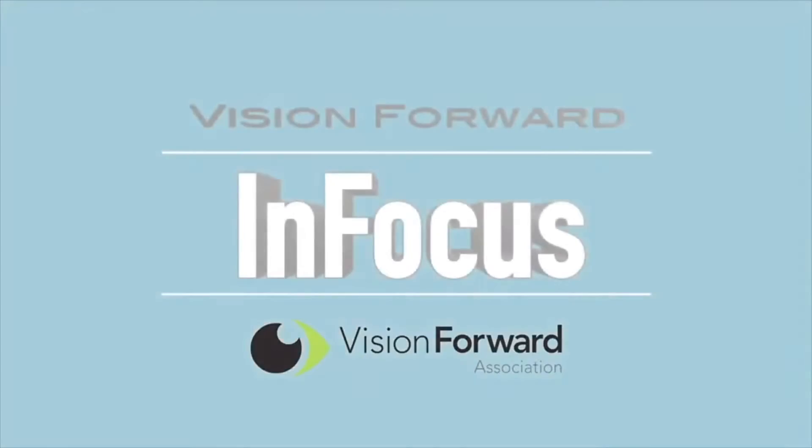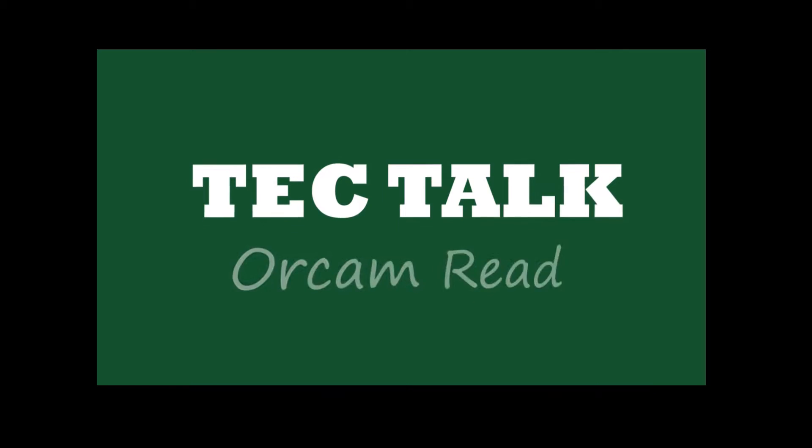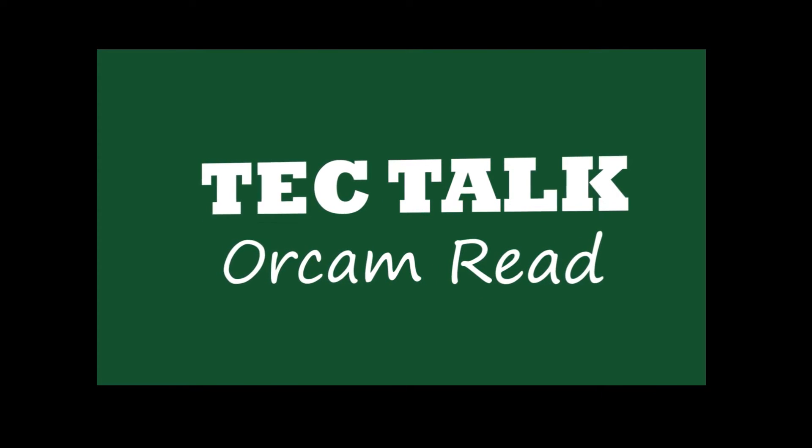VisionForward's InFocus team presents. Hello, this is Luke Scriven here at VisionForward. Welcome back to another InFocus Tech Talk. In today's Tech Talk we're going to be looking at the OrCam Read.